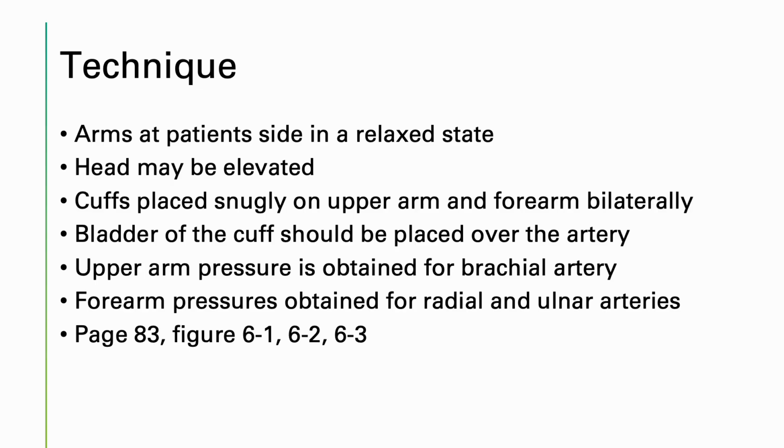So it is okay when you're getting the brachial artery pressure, you can listen to the artery at the AC. You can listen to the brachial there. You can listen to the radial artery or the ulnar artery. When you're getting ulnar and radial pressures, for radial, you need to come on the lateral side, down by the wrist. For ulnar, come on the medial side by the wrist.